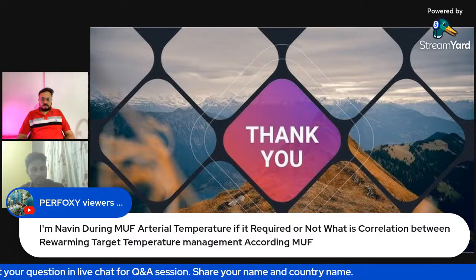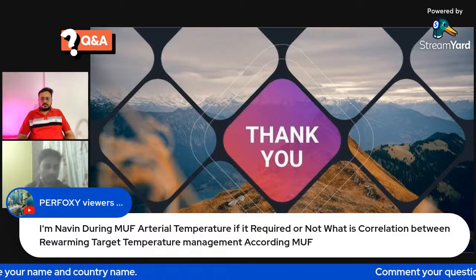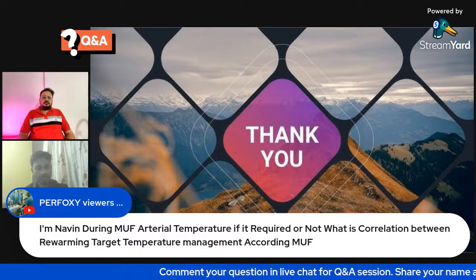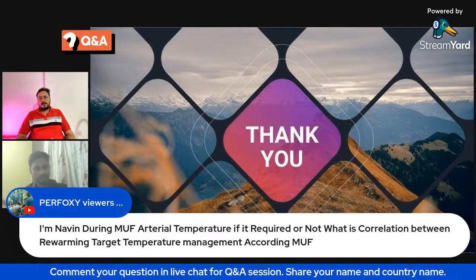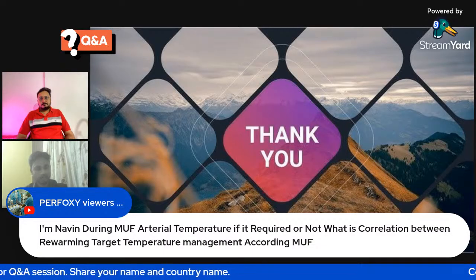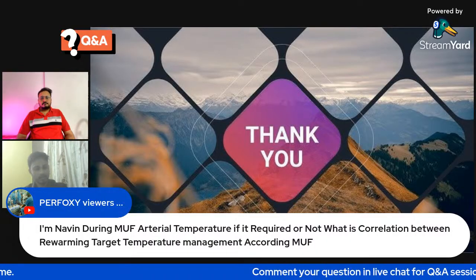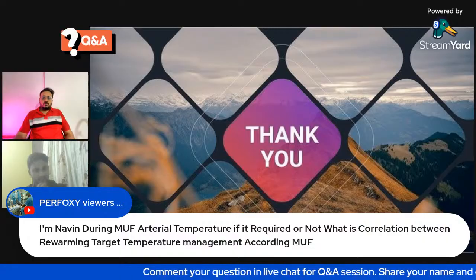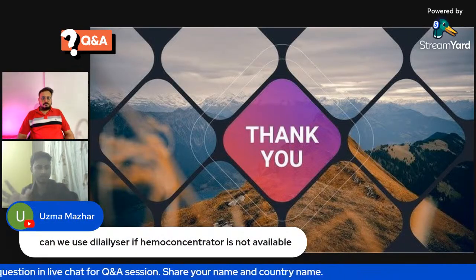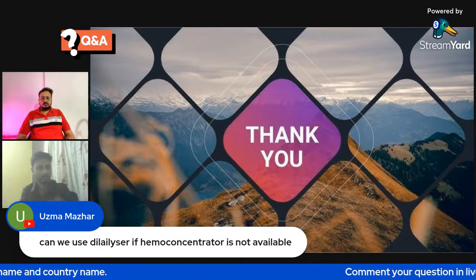It won't be cooled, so temperature management is not required. The blood is warm. If we are using a cardioplegia pump, some BCD, then it will be required because that is cooled. But if it is venous MUF and we connect directly from the ultrafiltration pump, temperature management is not required. During MUF we flow only a small amount, so it won't affect the patient's temperature.